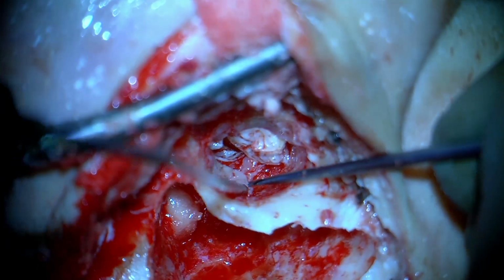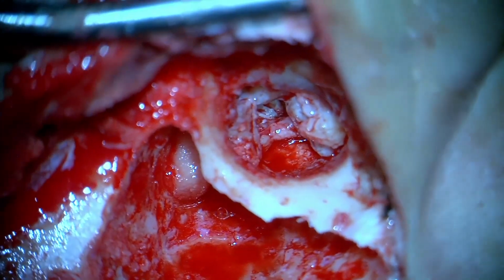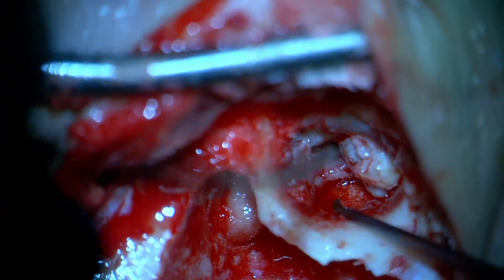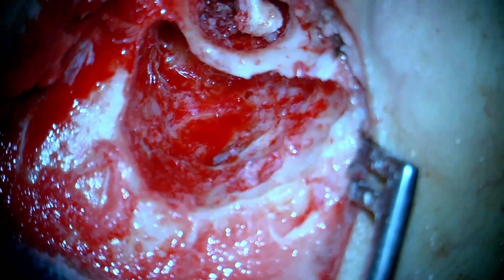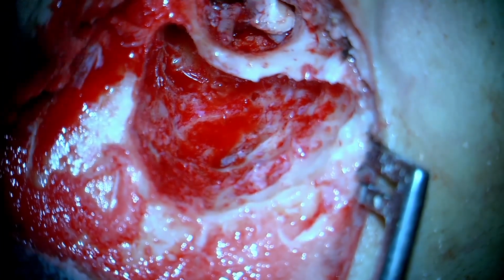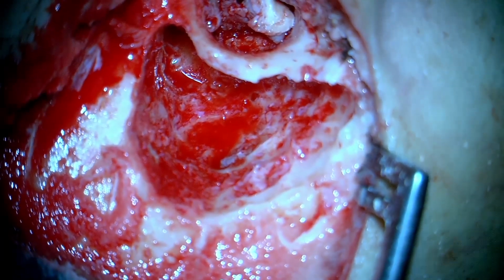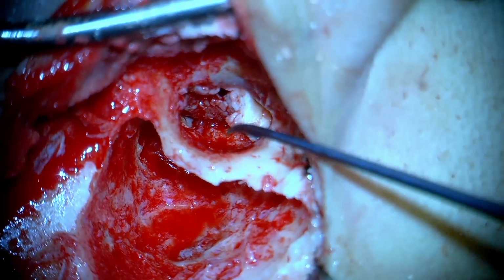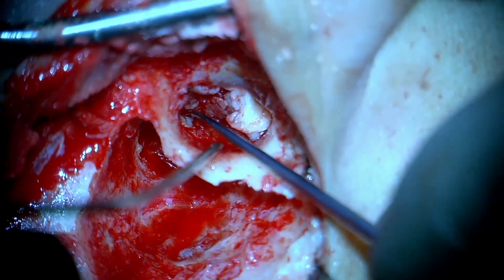One thing, everybody who does canal wall cholesteatomas must be very aware that when the canal is expanded because of the pressure of the cholesteatoma, or there is bone erosion posteriorly and inferiorly, one must be very cautious regarding the facial nerve as well, because sometimes even the mastoid segment in such patients can be exposed because of the cholesteatoma. The chorda tympani can be exposed, and one must be very careful in drilling on the canal side in these patients. We recommend using only diamond burrs and not cutting burrs, and also using soft tissue dissection techniques so as to not inadvertently cut anything till you have made sense of the location of the facial nerve in these patients.